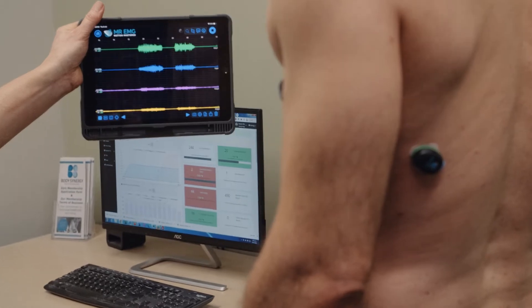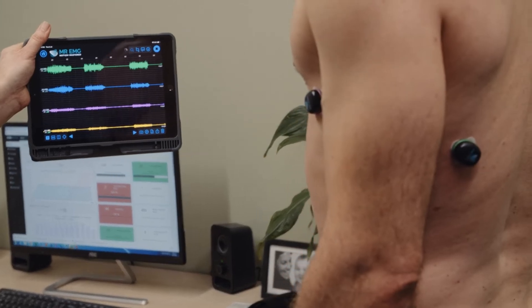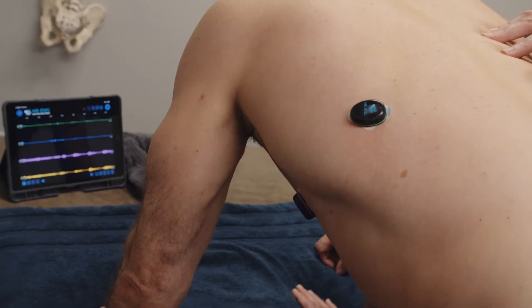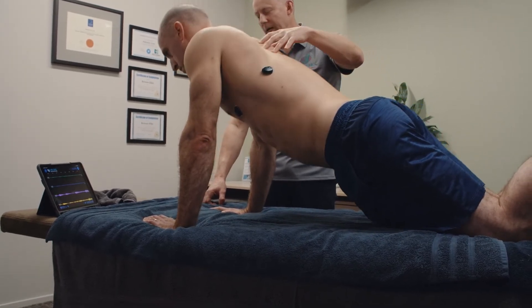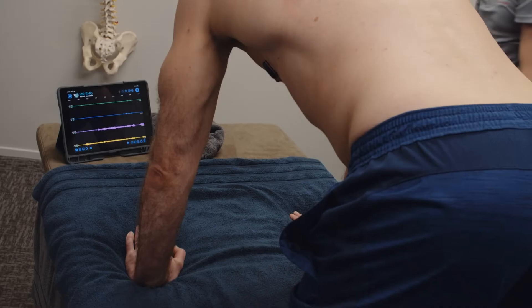We recommend you test movements most suited to your subject's symptoms, reflecting activities that may be a source of their pain. We will now assess the active engagement of the subject's serratus anterior muscles. To do this, we will perform a progression of movements starting in a simple four-point position with our subject flexing their thoracic spine up and down.